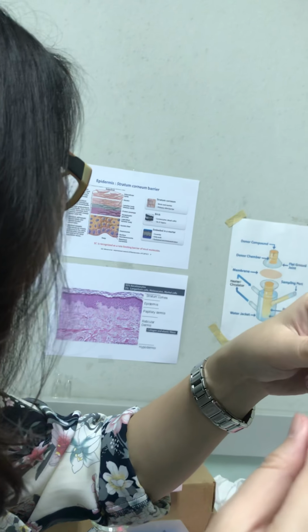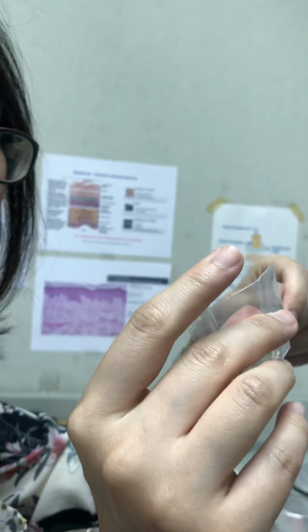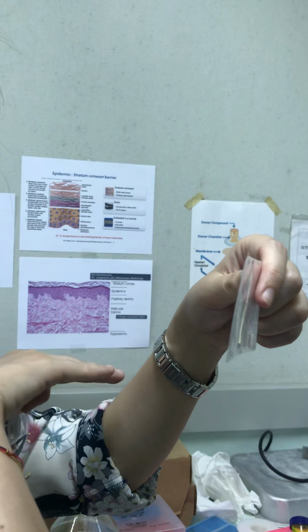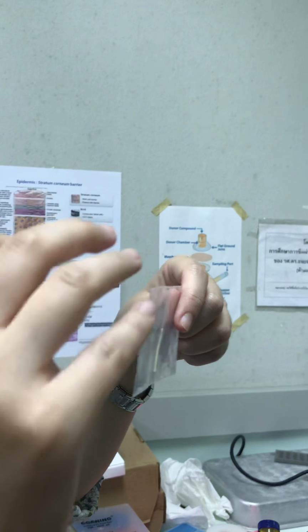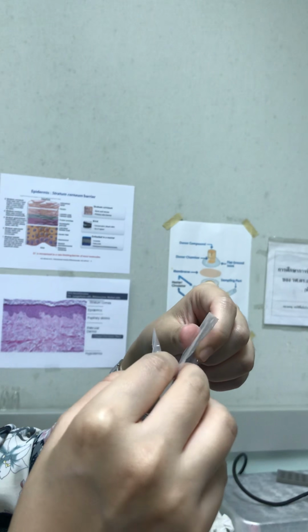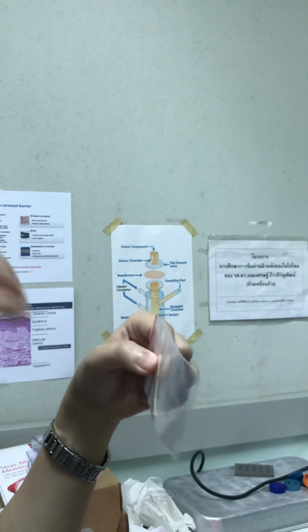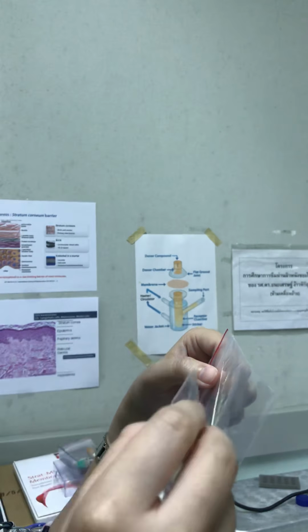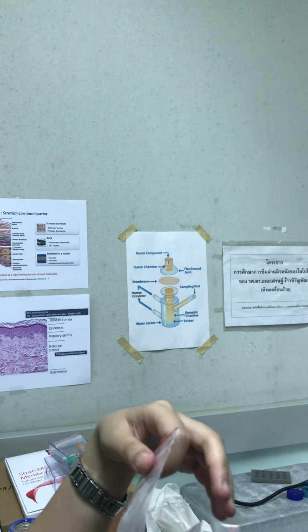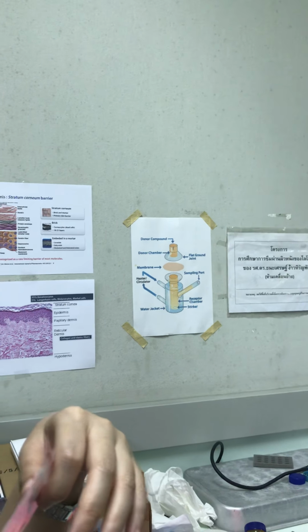One of the most important advantages of microneedle is that it only invades the skin in the epidermis or upper dermis layer, so we think it does not penetrate into the nerve endings. So maybe you feel no pain or just a little pain compared to traditional injection.